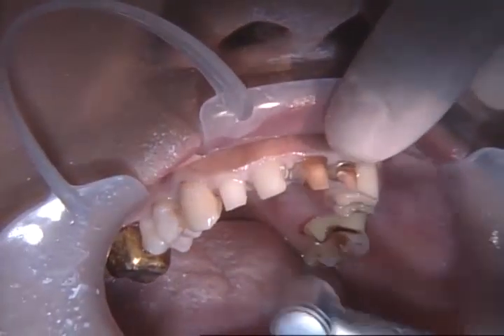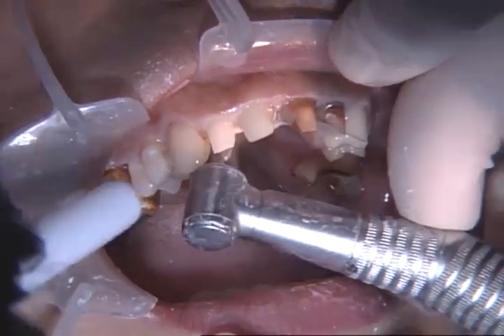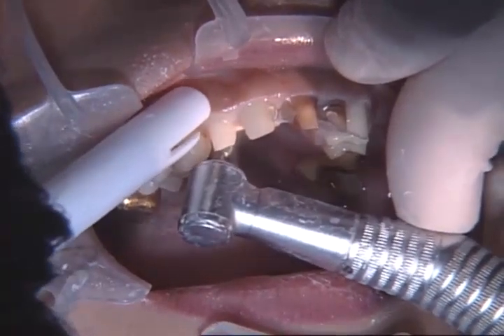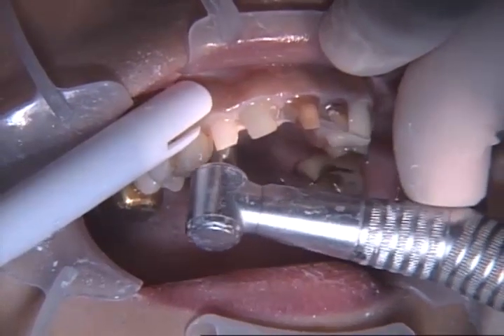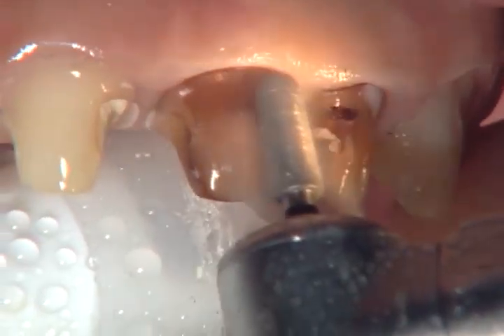Lingual reduction is accomplished with the football burr, the 379-023, as well, again because of the convex shape of it. It gives a nice concave lingual surface. And you can see the margin is pretty much done as I go in there and just finish up some things. And we're not going to press on this appointment.